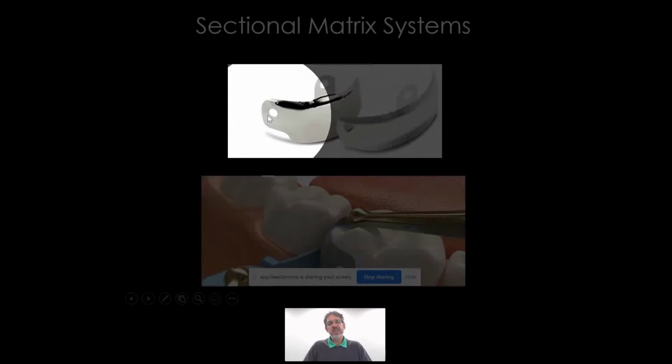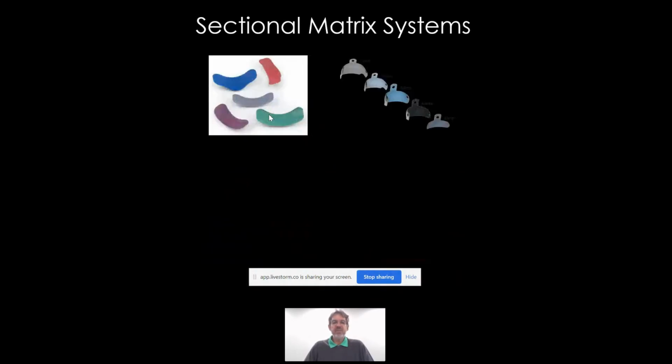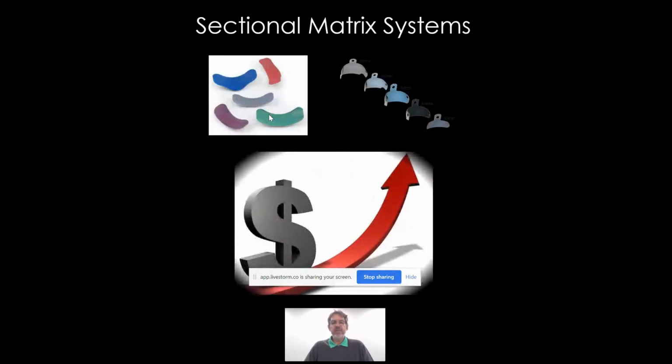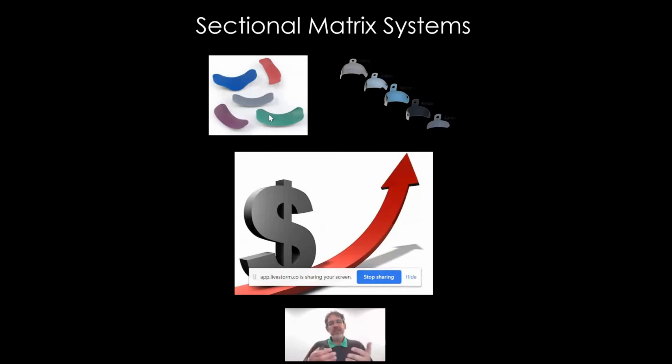So many times what happens is when you're engaging your little pin tweezer to remove it, the band tended to tear. So many of the manufacturers added a Teflon coating to their bands, and it was proven in research to reduce the adhesion of composite or bonding agent to the band by up to 92%. But there was the issue of increased cost.